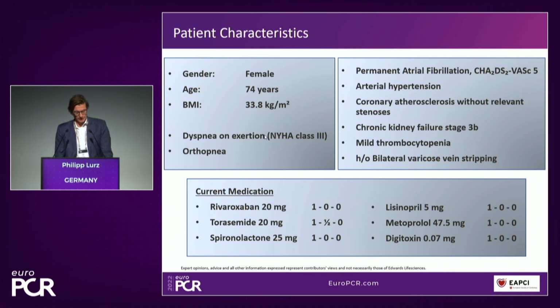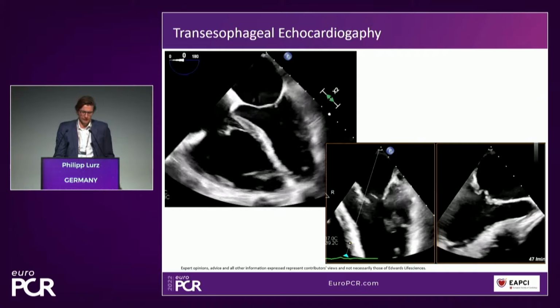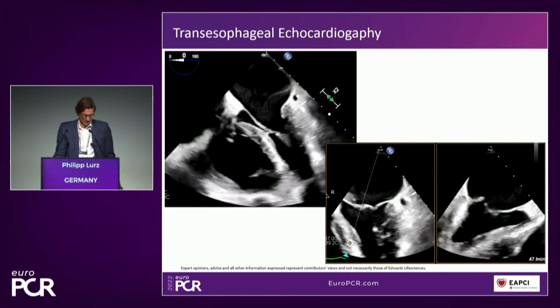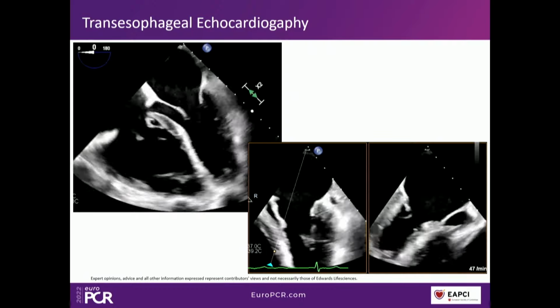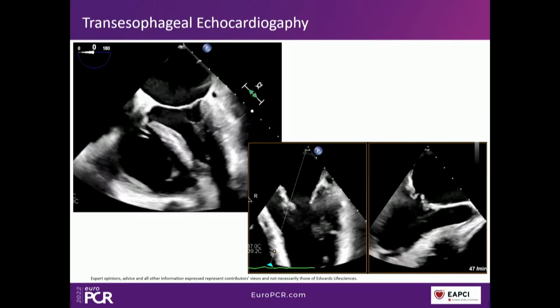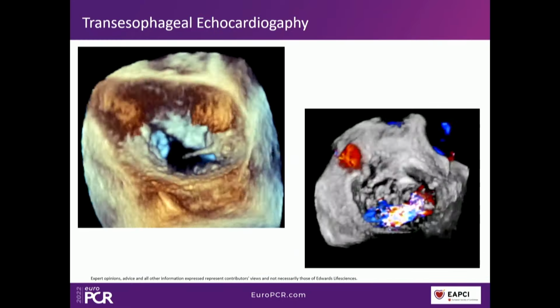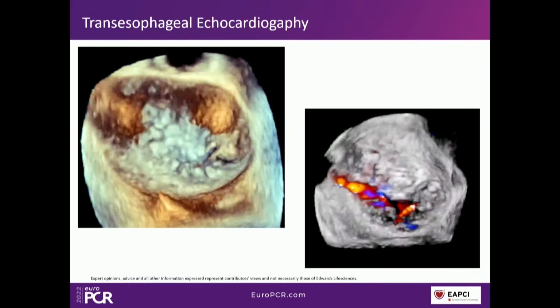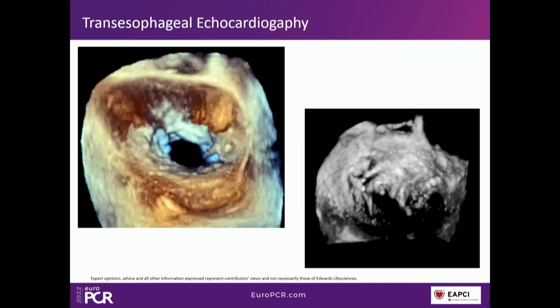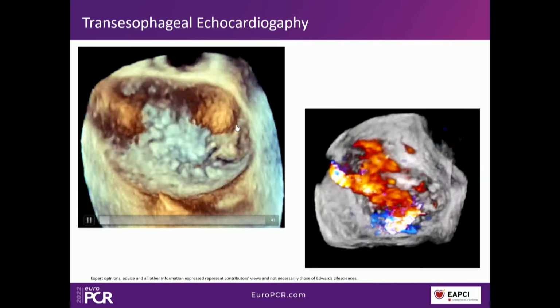Her current medication is summarized here, and you see that it already includes a couple of diuretics. So that's probably the most important slide. You see the echocardiogram of that patient. Left ventricular function is well preserved. Nothing too exciting in the four-chamber view, but on the right you see the X-plane view, and on the long axis you can also see the pathology. Obviously something is not quite right, and it refers more to the medial aspect of the mitral valve. This is a 3D image. You can see there's severe mitral regurgitation, and this is due to a medial commissural pathology. I phrased it quite vaguely because it could be interpreted in different ways, but it's commissural, and there is a pathology.